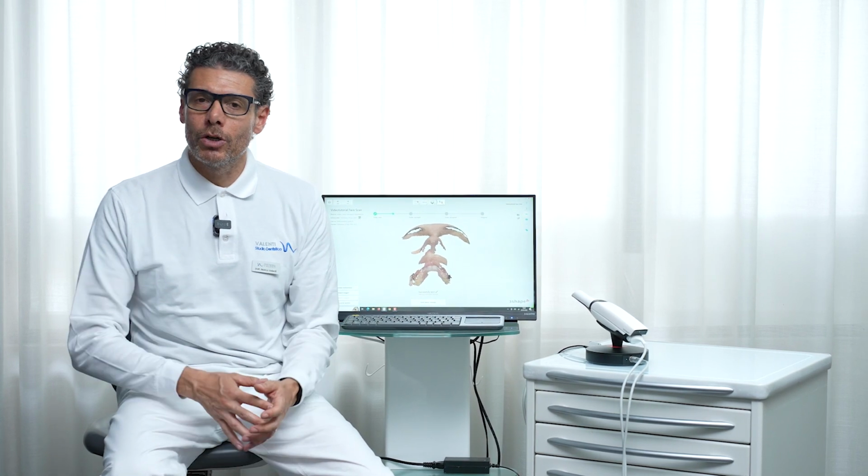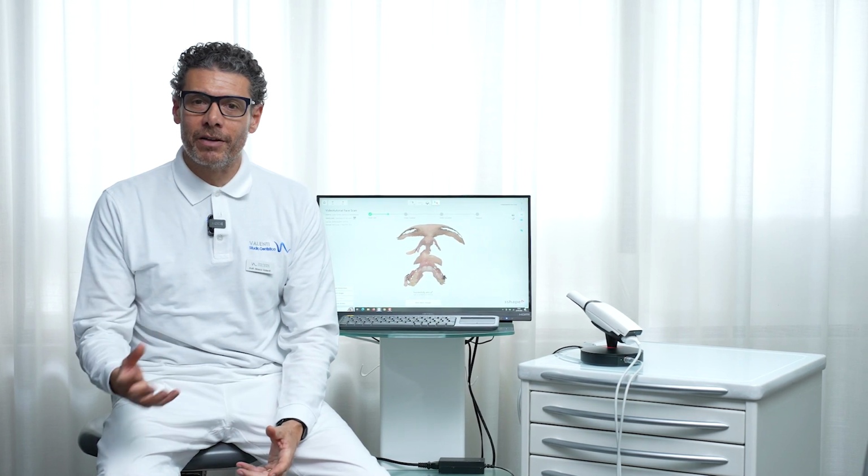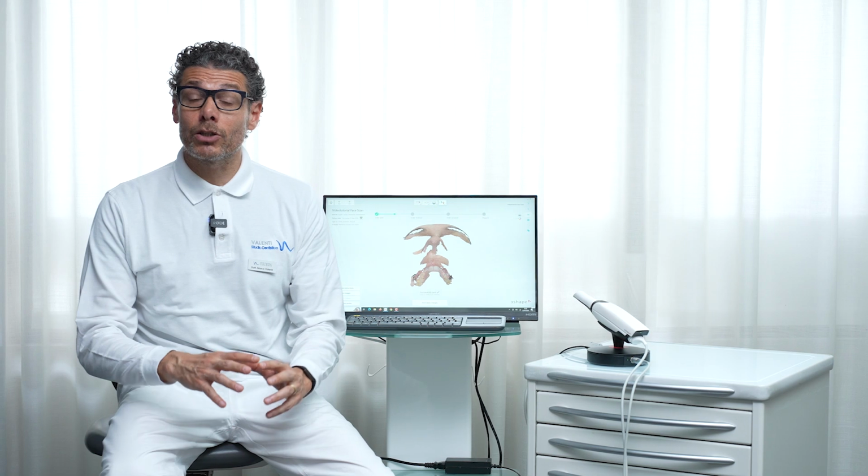At this point, I will hand over to Laura, who will demonstrate what happens within the dental system.